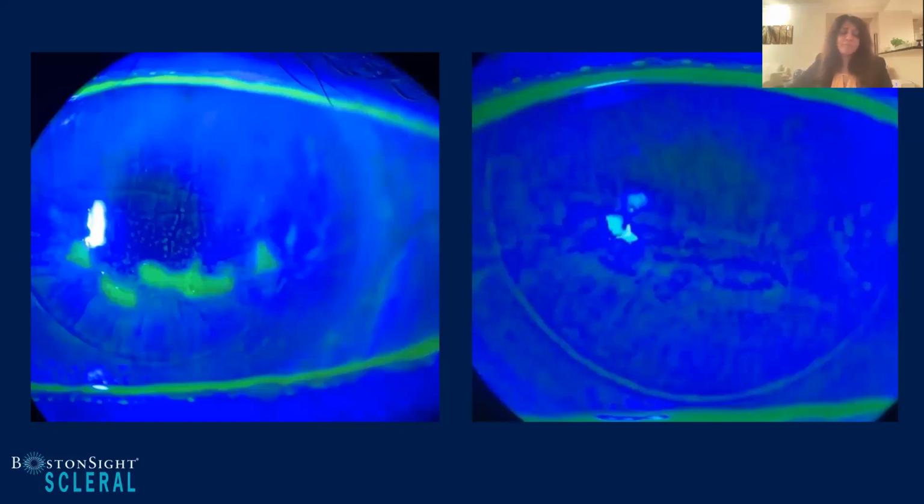So you can see now this is about 2 months after she's been wearing the lenses. And you can see here the difference when we first started and once we are near the end of our fit here. I have seen this, Avani, I know you've seen this time and time again, where the therapeutic benefits of what scleral lenses can do on corneas, where people have given up hope and said there's nothing else we can do. I have seen it time and time again where scars have improved, where vision has maximized even after 6 months, a year later, 2 years later.